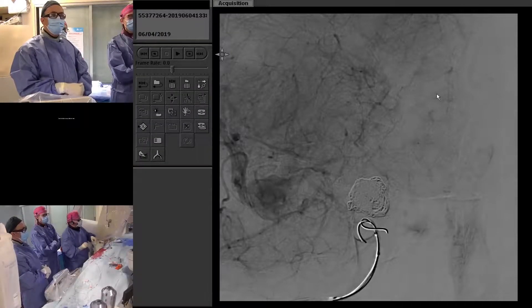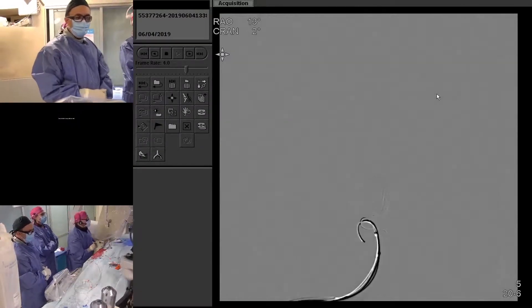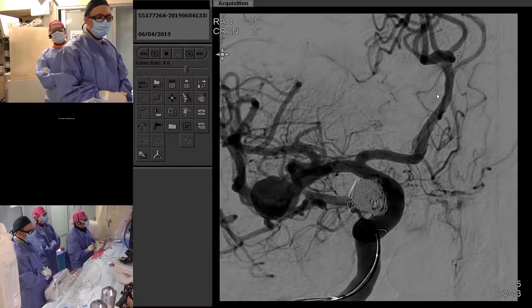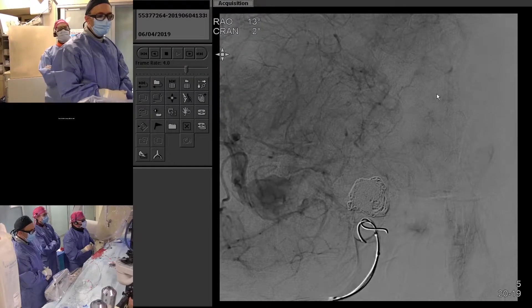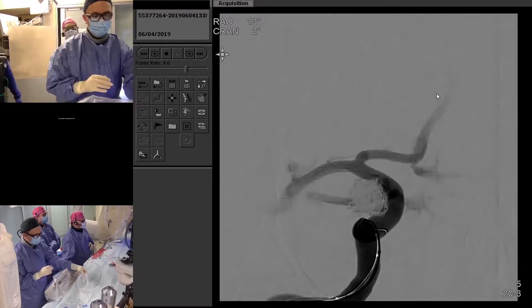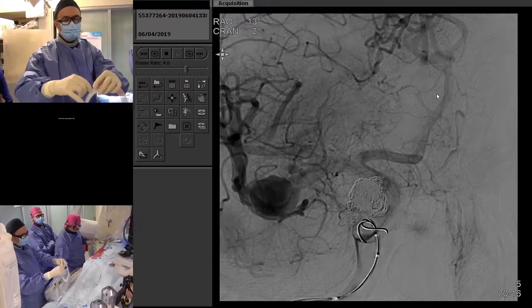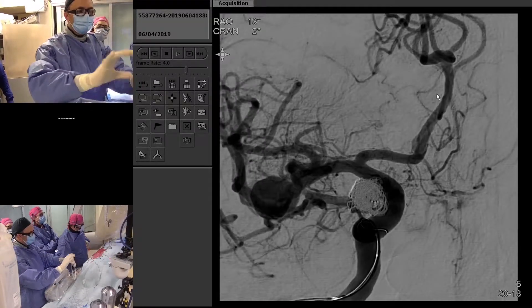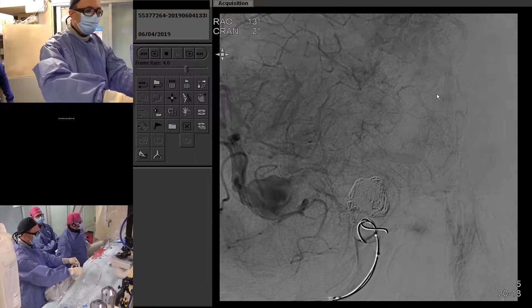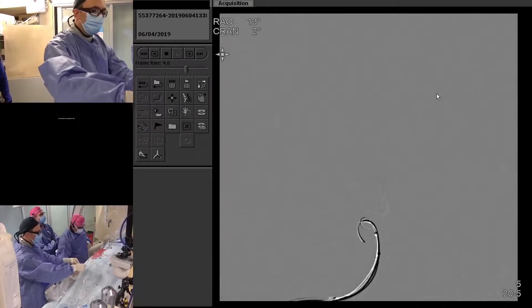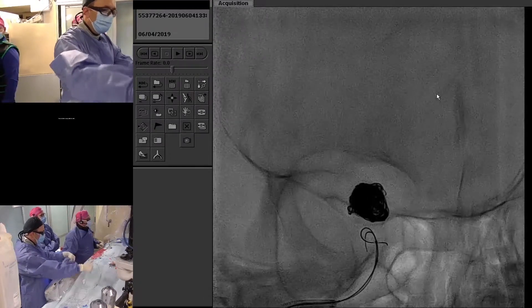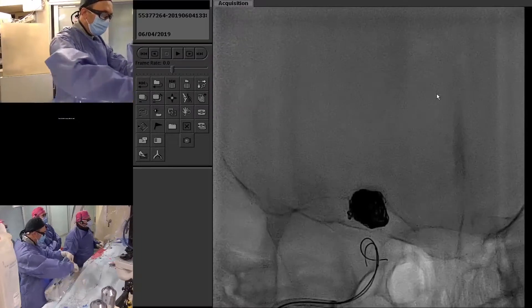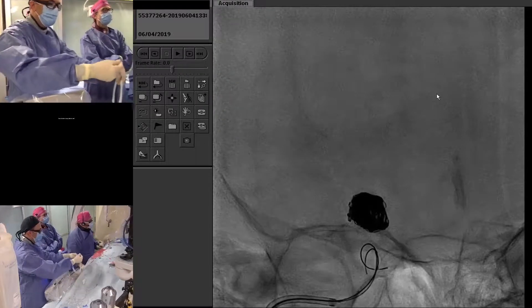We're getting the first imaging and working projections. There's actually an aneurysm complex at the bifurcation — a smaller aneurysm coming off the frontal or superior division, and a larger, more round one that looks like a ball coming off the inferior division. The larger one is the one being treated today, either with straight coil with balloon protection or balloon-assisted coil embolization.